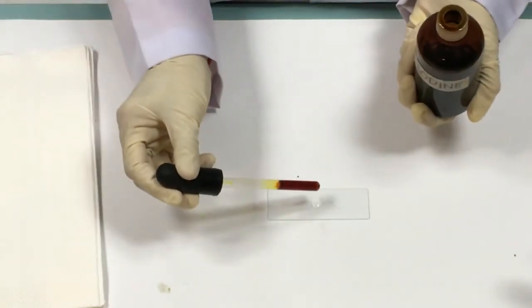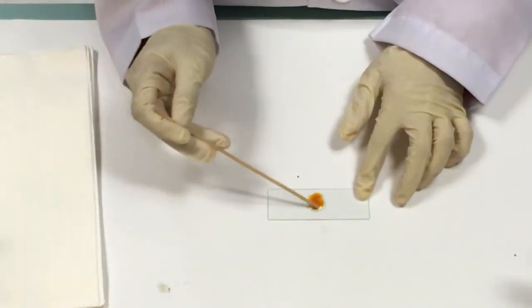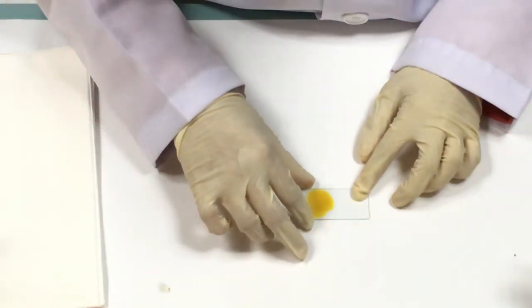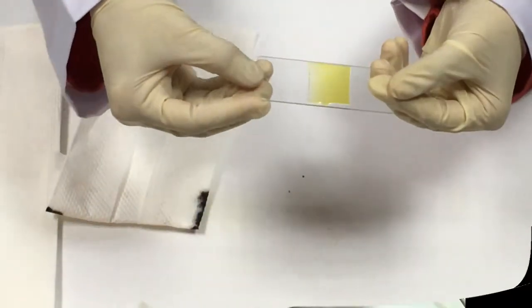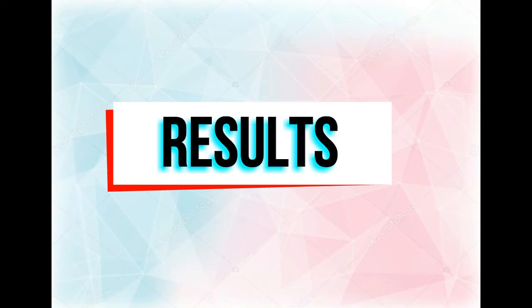Add 1 drop of iodine and mix it well by using wooden stick. Put a cover slip and avoid air bubbles. Finally, examine the slide under the microscope with 40 times magnification.